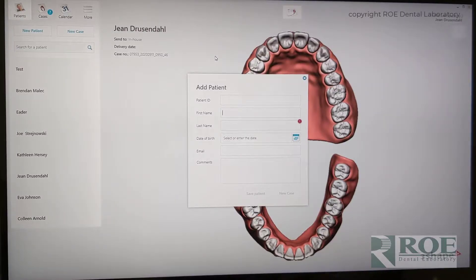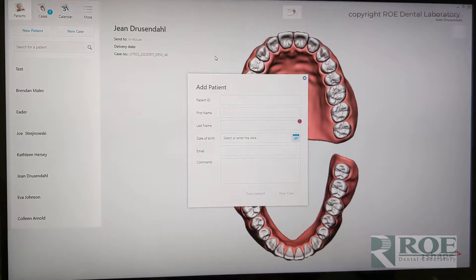This video is going to show how to scan for an iJIG single arch.